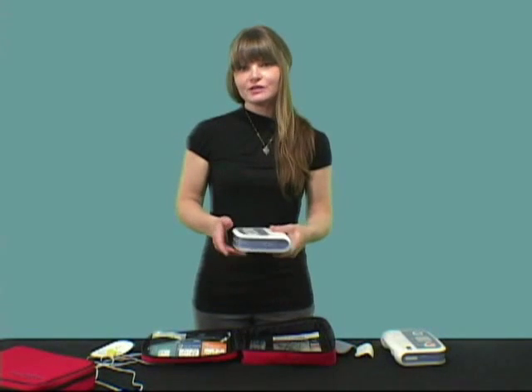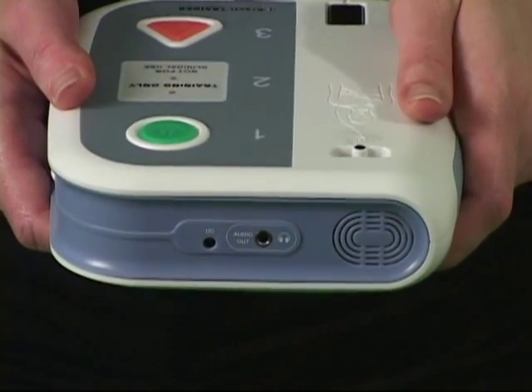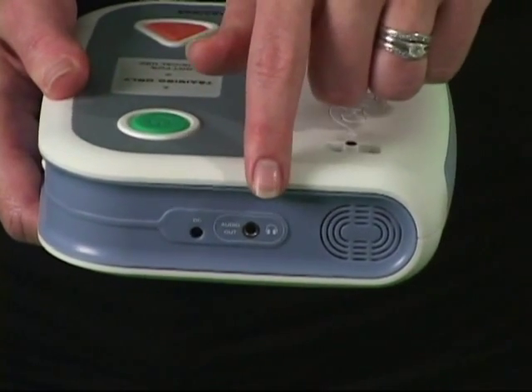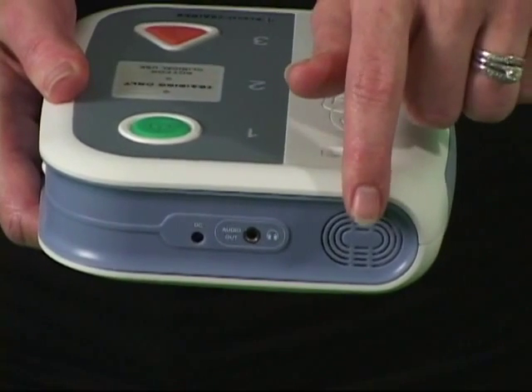If you choose not to use battery power, there is an input for the power cord on the top of the trainer. There is also an audio jack for external speakers or headphones and a loudspeaker.